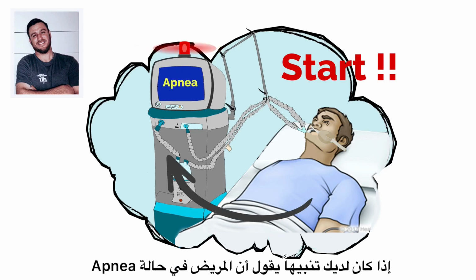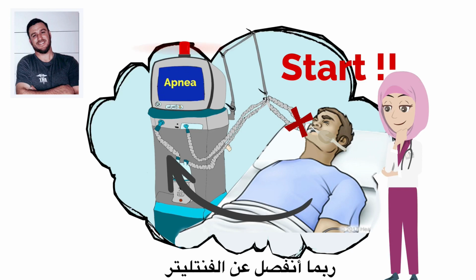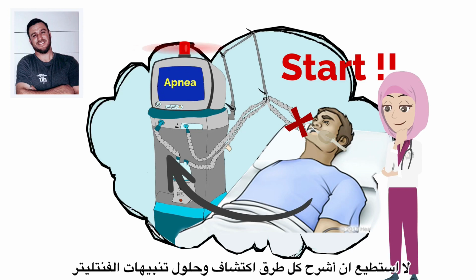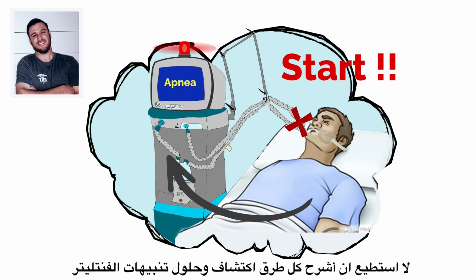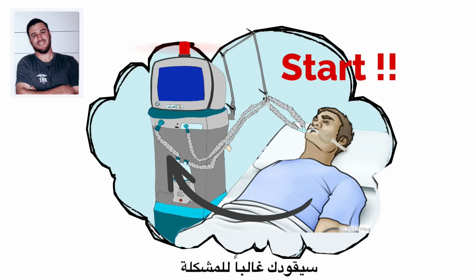If you get an alarm that says apnea, look at the patient. Are they breathing? Maybe they've become disconnected. I can't break down all the different troubleshooting alarms, but if you always stay calm and start at your patient, most of the time it'll lead you to the problem.